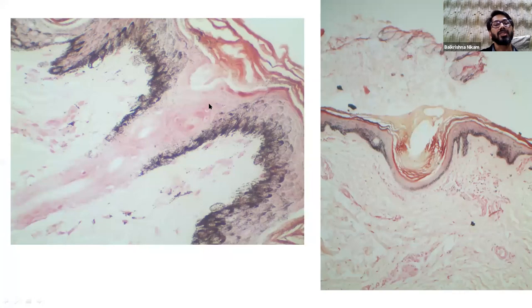It's not air, it's not stratum corneum. It's just these epithelial eccrine tubules which are producing the white thing because there is a break in this. Compare it with the follicular epithelium, which is in continuity with the epidermis. It's not breaking or perforating the epidermis. That's why most of the follicular openings are not clearly white unless this area is less melanized. I mean, if it becomes completely hypomelanized, it can appear white also.